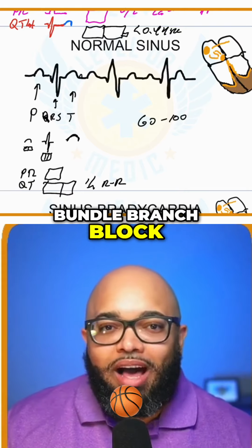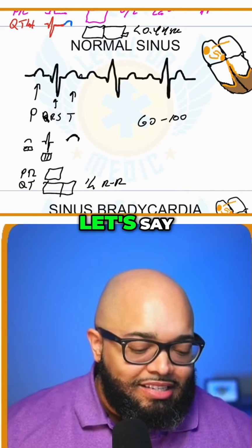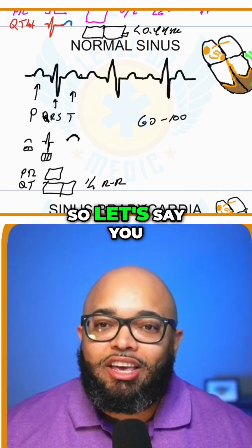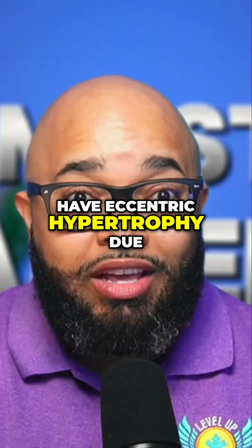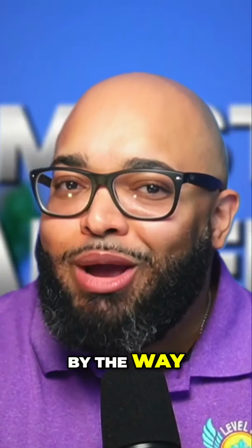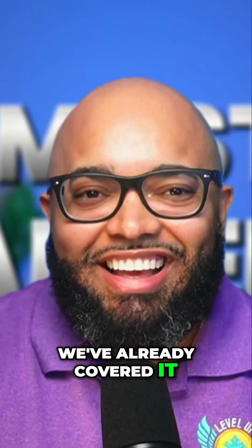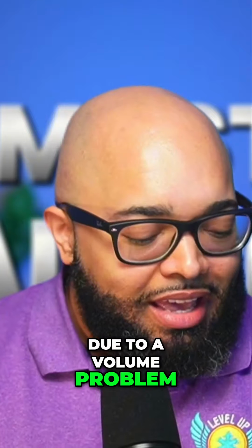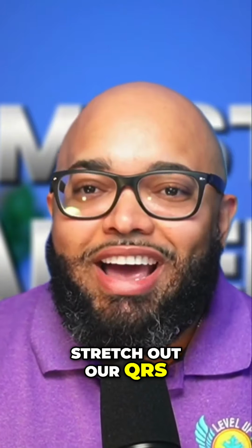It could be a bundle branch block. It could also be, for instance, let's say you have ventricular dilation. So let's say you have eccentric hypertrophy due to volume overload. By the way, what heart sound is that? We've already covered it. That's going to be an S3 heart sound due to a volume problem, but that's going to stretch out our QRS.